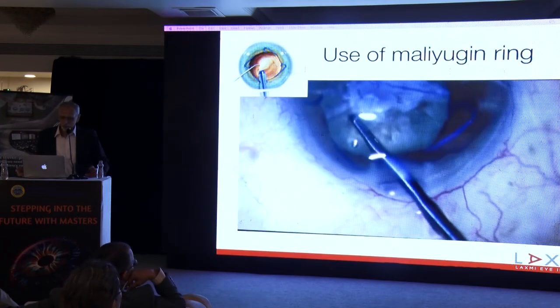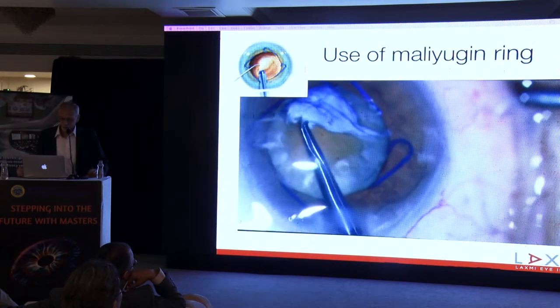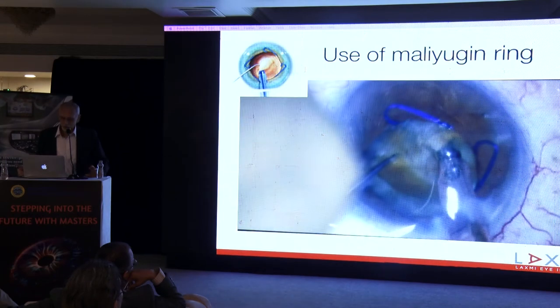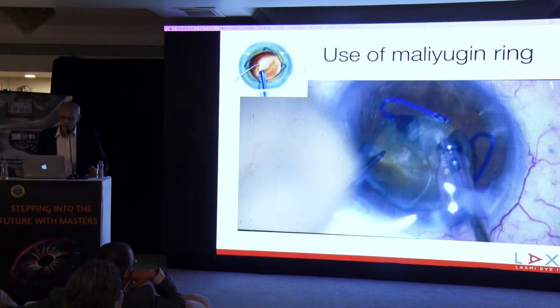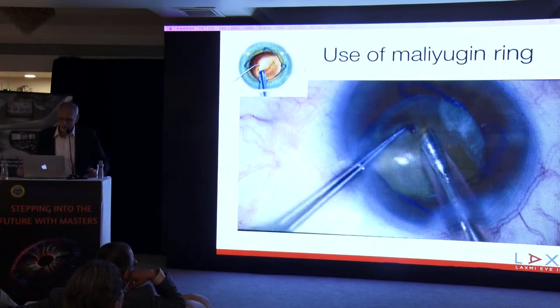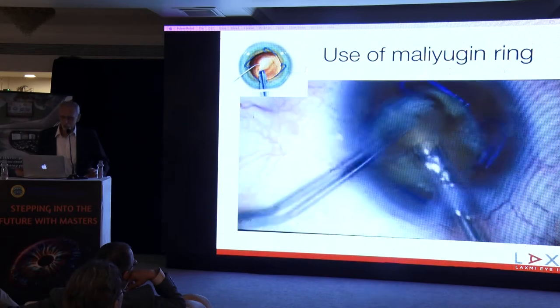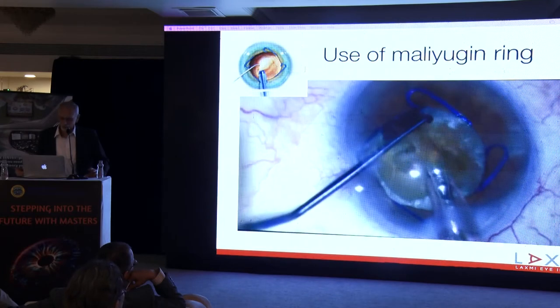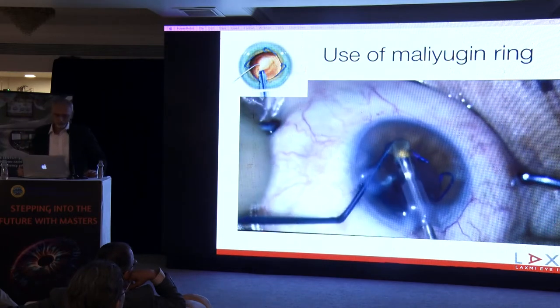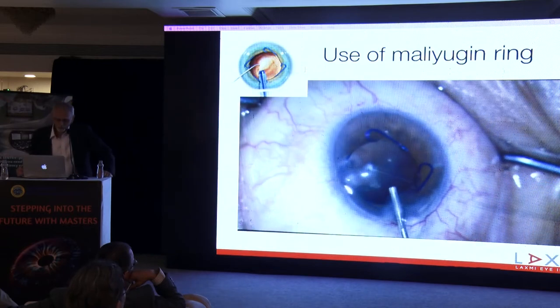And doing rexis on a fibrous capsule is always a tough issue. Very often, the rexis may not be complete. Sometimes you may have to use your scissors to extend it. Sometimes it may not be continuous, it doesn't really matter because they don't tear into the periphery. But here the nucleus management becomes a little bit of a challenge.